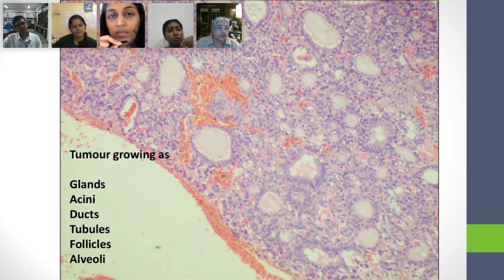It's a spherical structure. It may or may not have a lumen. The one in the thyroid and the one in the ovary have a lumen, but they are all spherical wherever they occur. So that's why we call them follicles. Now you can see that these are all one shape. That tells you something. Glands are not spherical. Glands are all kinds of different shapes.